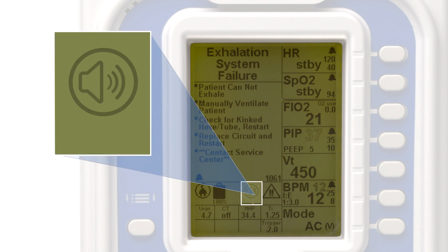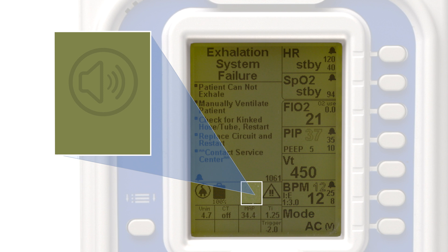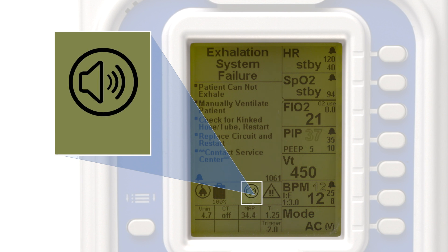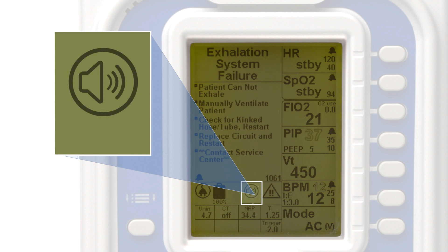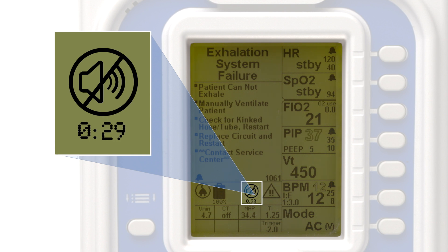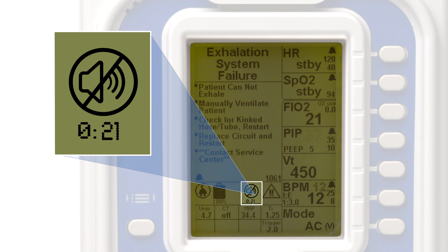During an active alarm, a speaker icon will appear in the icon tray, accompanied by an audible beeping sound. The user may mute the alarm for 30 seconds by pressing the Cancel button. When muted, the speaker icon changes to one with a strikethrough and a countdown timer appears underneath, indicating the time remaining until the alarm resumes its audible alert.